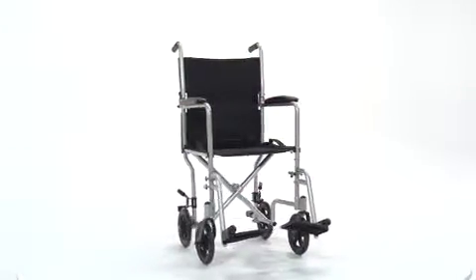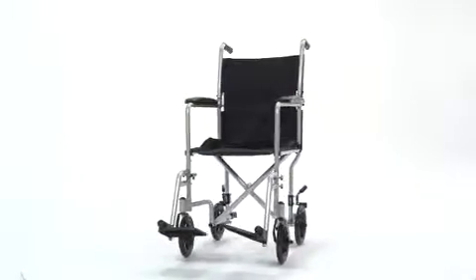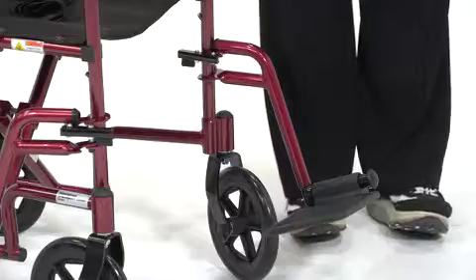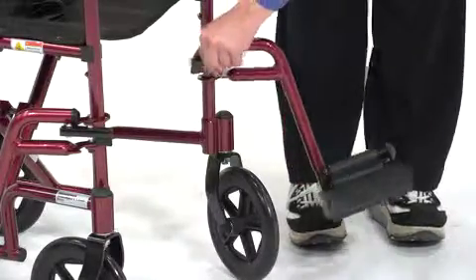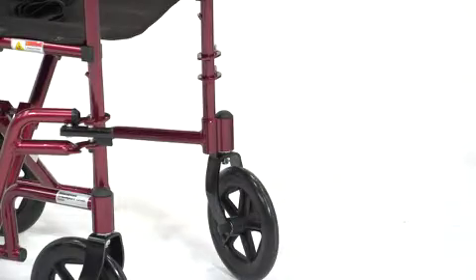Other than attaching and detaching the tool-free, swing-away footrest, the lightweight transport chair is assembly-free. To remove the footrest, simply release the lock, swing outward and rearward, and then lift the footrest up and off.